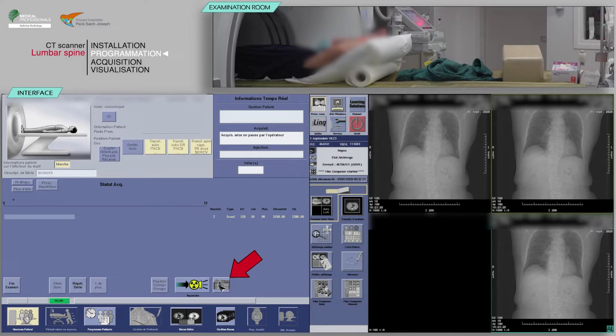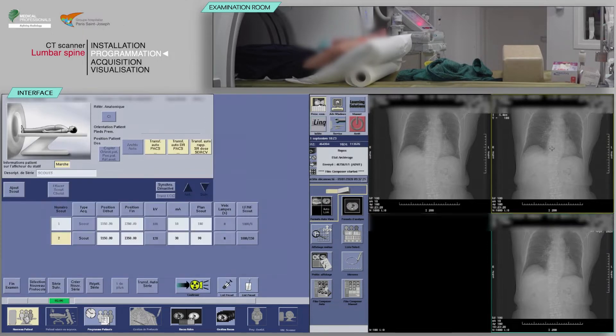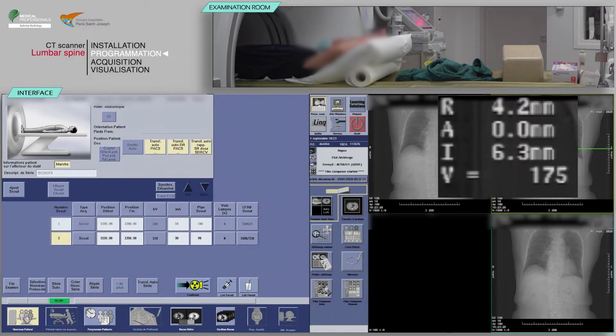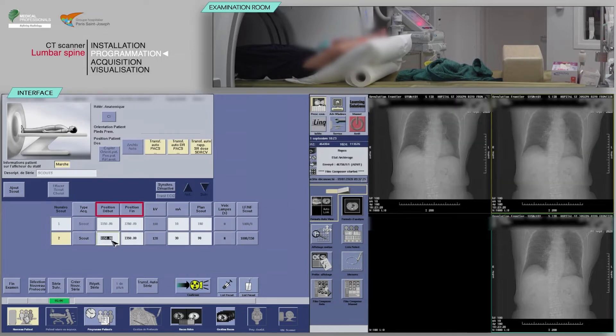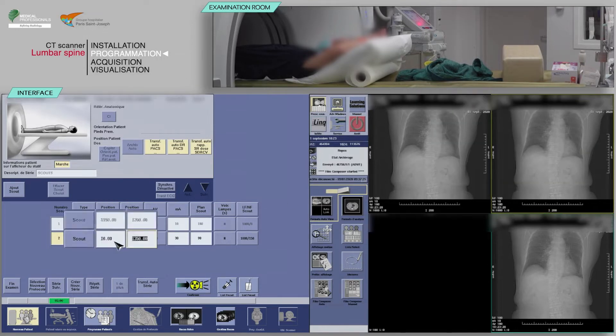Then, on the image at the top right, move the mouse to locate the beginning of the lateral acquisition and modify the values in the start position and end position.